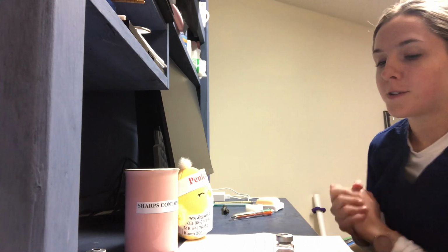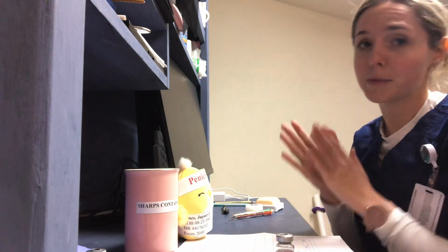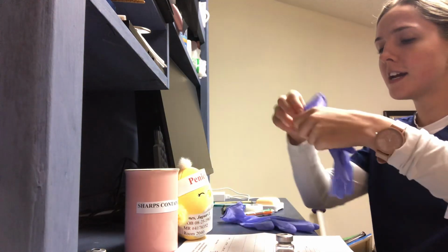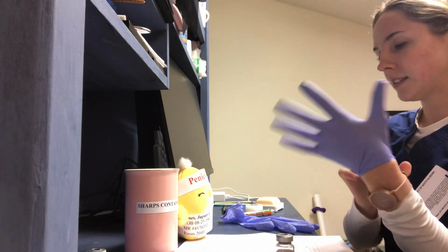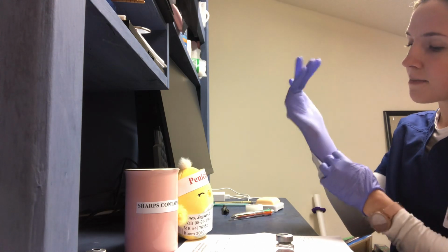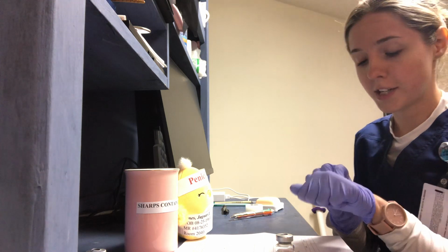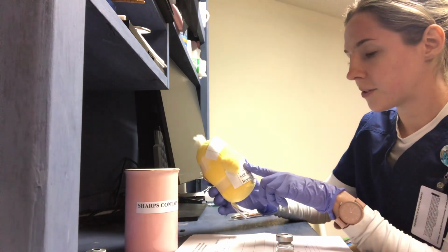Hi, Mr. Jones. Well, first I'm going to hand hygiene. Then I'm going to raise your bed up to a good working height. I'm going to put on some clean gloves. And I'm going to check your armband to see if it matches. We're going to perform those 7 rights all over again. So we're going to double check we have the right patient here.